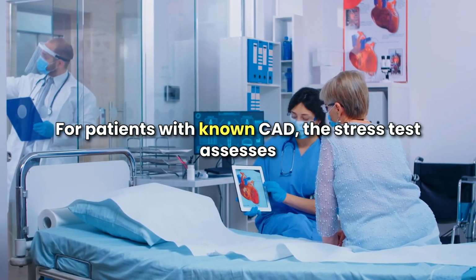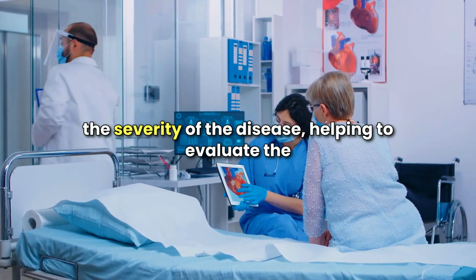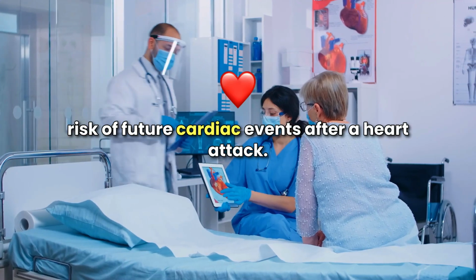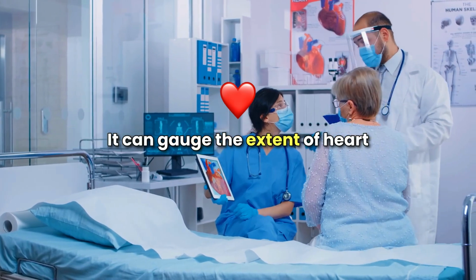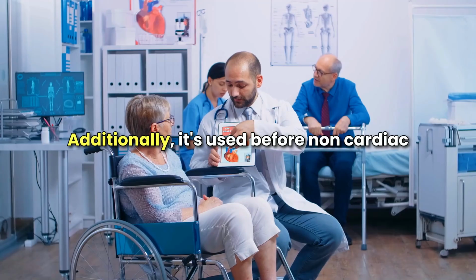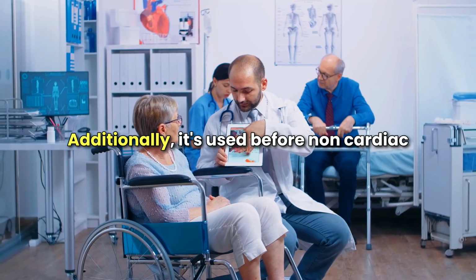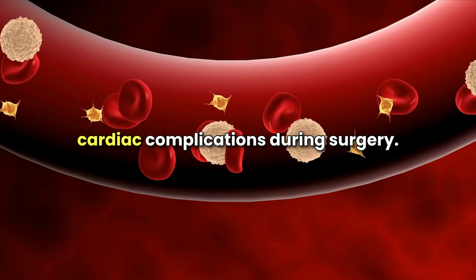For patients with known CAD, the stress test assesses the severity of the disease, helping to evaluate the risk of future cardiac events. After a heart attack, it can gauge the extent of heart damage and the likelihood of further complications. Additionally, it's used before non-cardiac surgeries to assess the risk of cardiac complications during surgery.